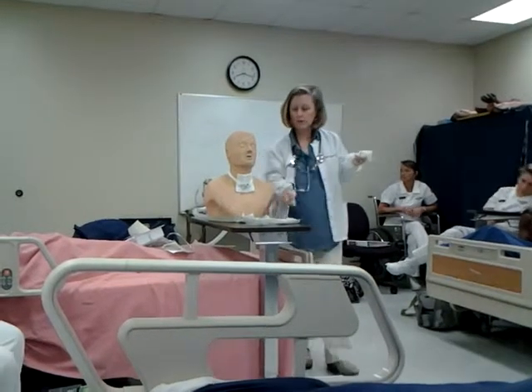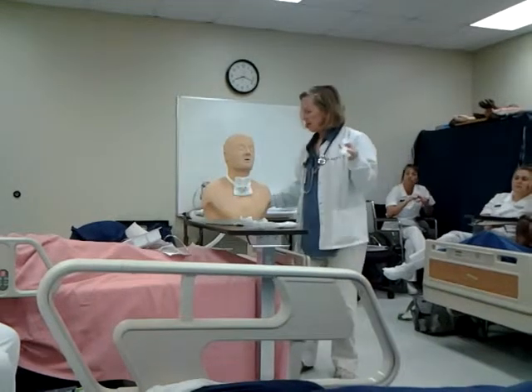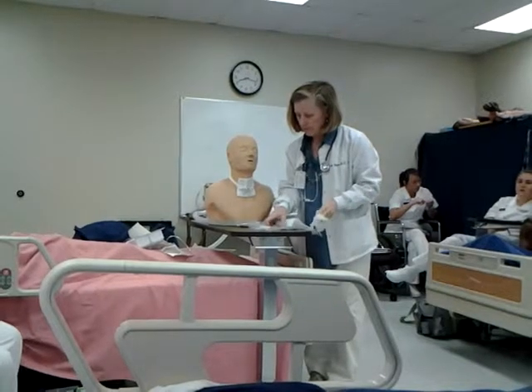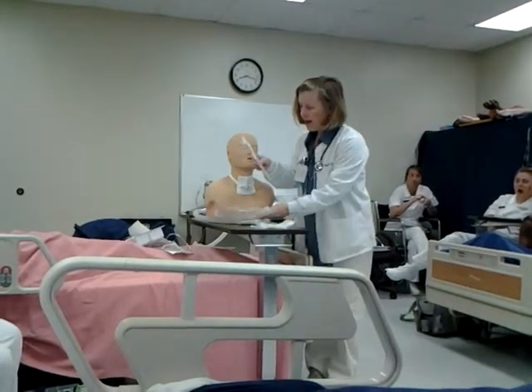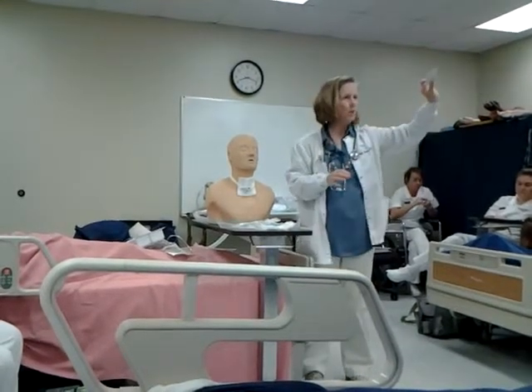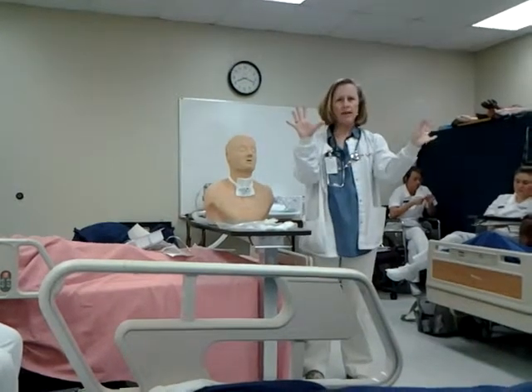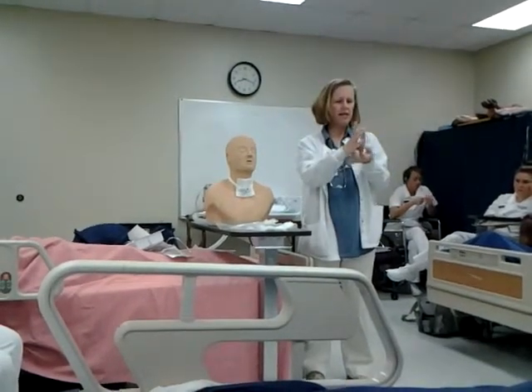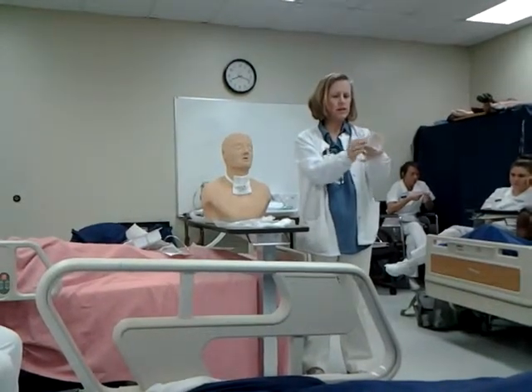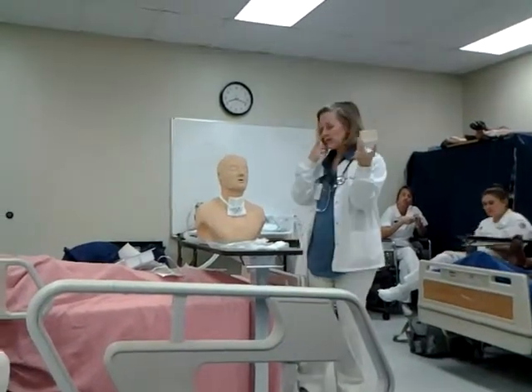Your kits with your suction catheter will have a pair of sterile gloves in them. Mine does not. So I'm going to put this in here. This one has this, which is a little box that pops open. Now, I have bare hands, correct? So the outside of this is contaminated, correct? So you just pinch the sides together and you have a little box. And that is useful. And this is for our saline.